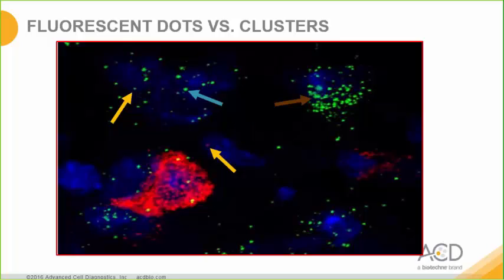Similar patterns of dots and clusters are seen in fluorescent versions of the assay. The orange arrows point to single mRNA molecules with fewer double-Z probe pairs bound to them, compared to the dot pointed by the teal arrow. And the brown arrow points to a cluster with an irregular shape, rather than a round shape, which has resulted from overlapping signals from multiple mRNA molecules.